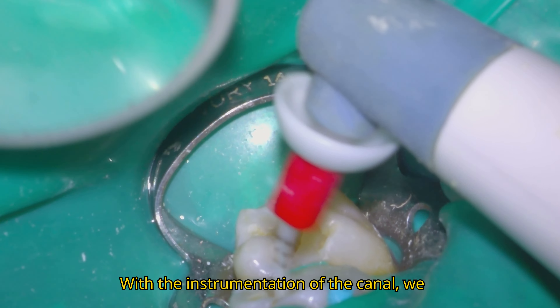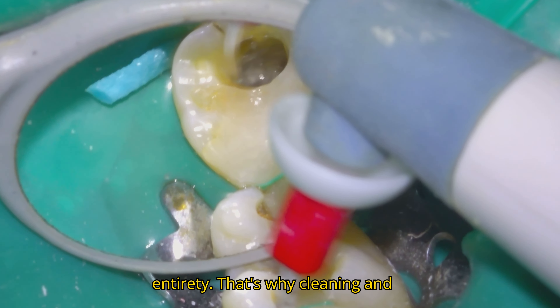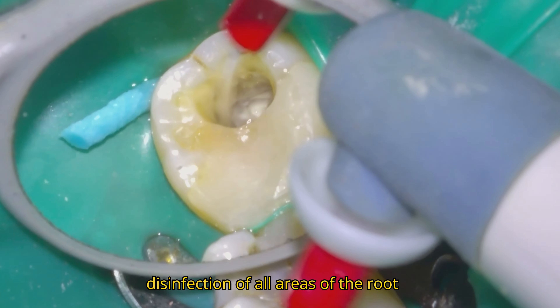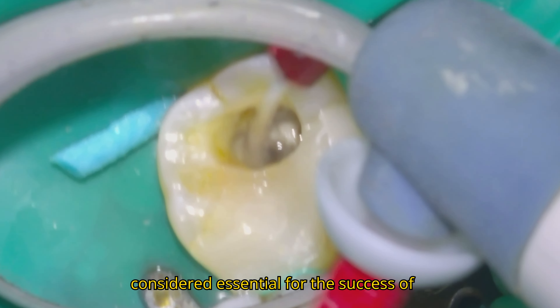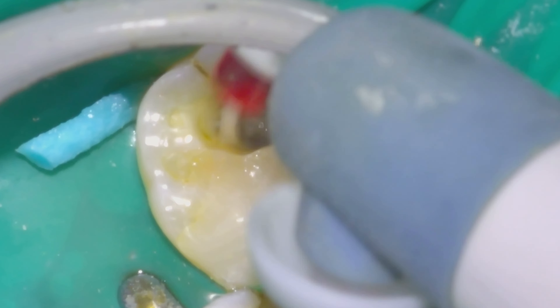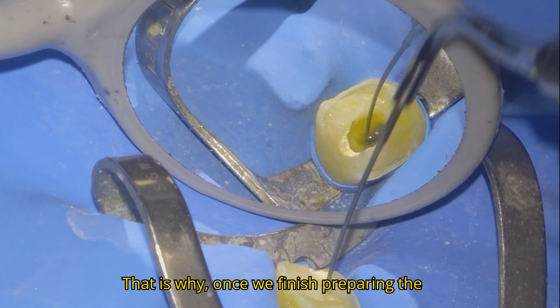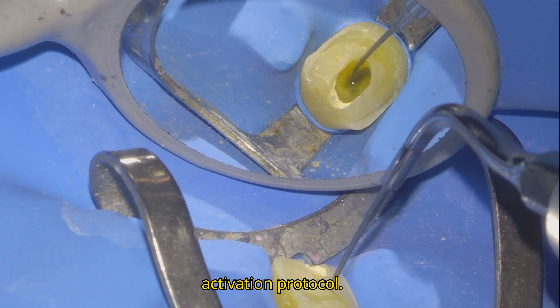With the instrumentation of the canal we never managed to treat the canal in its entirety. That's why cleaning and disinfection of all areas of the root canal using irrigating solutions is considered essential for the success of endodontic treatment. Once we finish preparing the canal, we carry out an irrigant activation protocol.